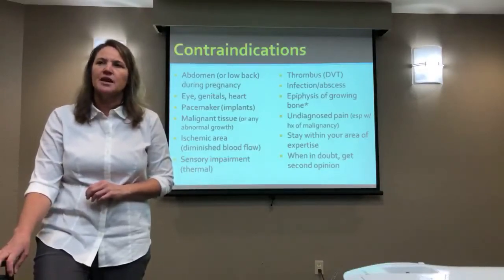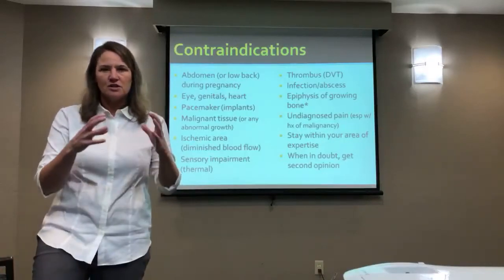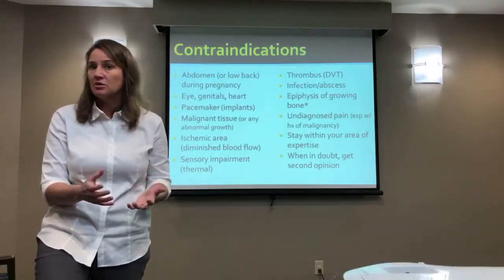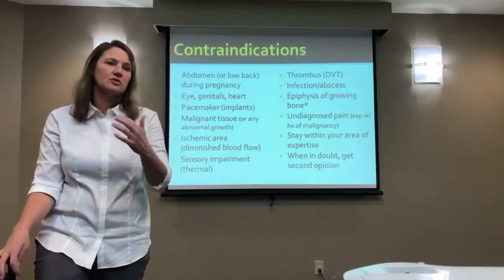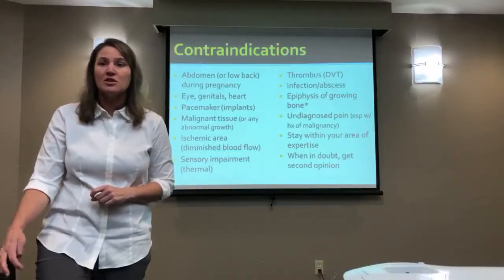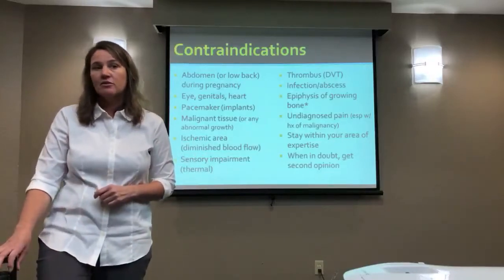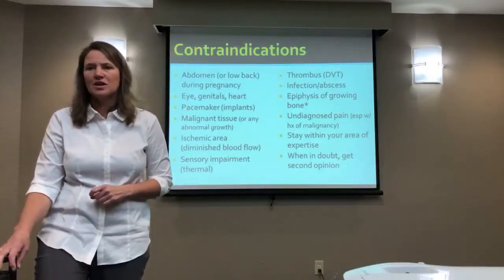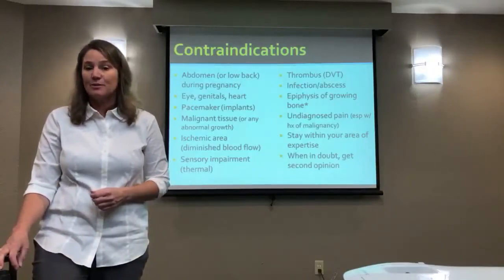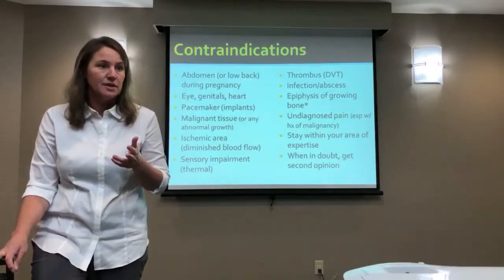I do think, again, for PTAs and COTAs who didn't evaluate a patient, if the evaluation and plan of care direct you to do ultrasound in some way and it doesn't make sense to you, go back and ask why they want me to do it, so you can better understand the purpose of it. And again, they shouldn't be insulted. I do think sometimes it can be tricky to manage that relationship, but I would certainly never be upset with somebody who came to me and said, I want to understand what I'm doing with the ultrasound so I can make sure I'm doing it properly. If I looked back and said, now that I think of it, I don't think we should be doing it, I would be grateful rather than upset.